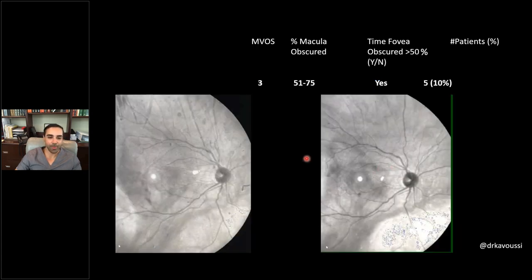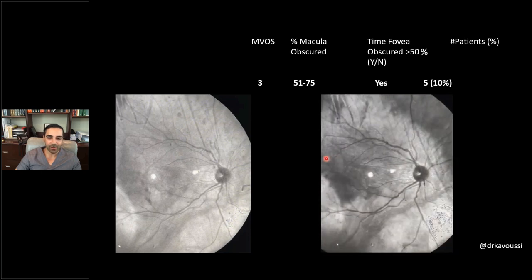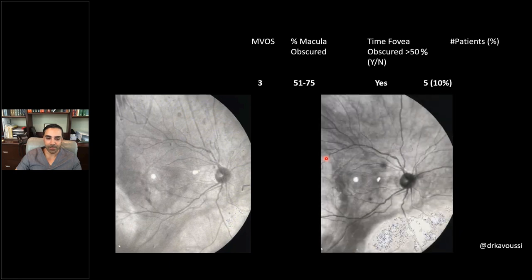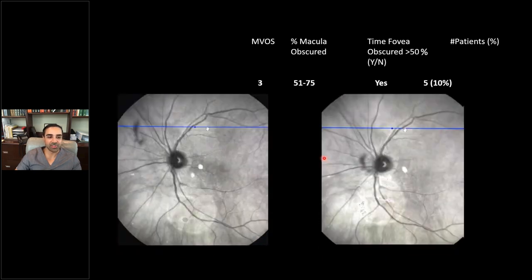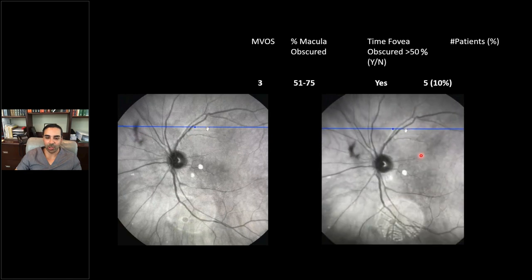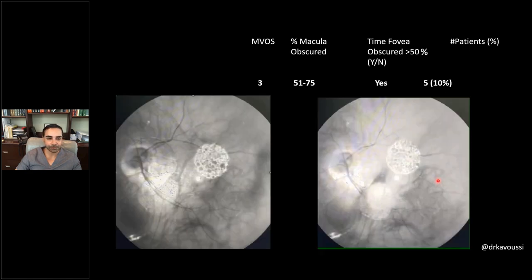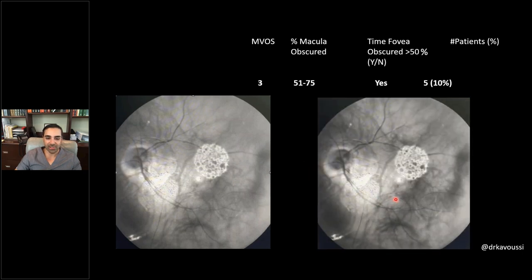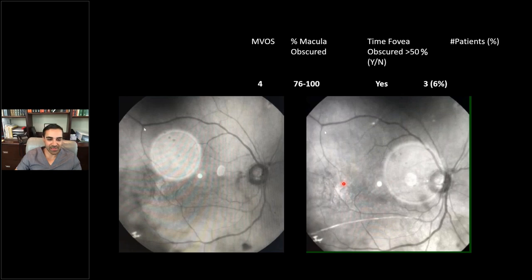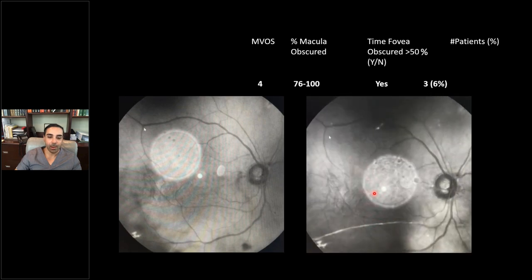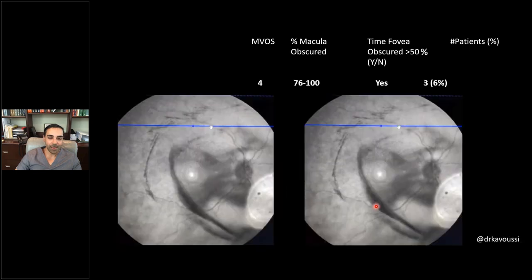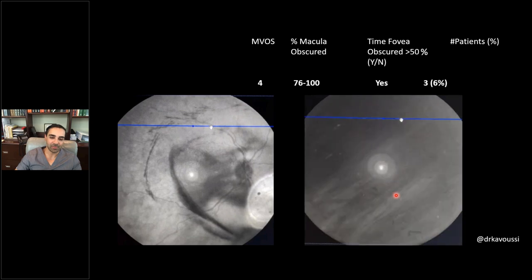Grade 3 involves opacities covering more than half of the macula — you can see them much better when you activate the video. On another grade 3, the still photo shows a Weiss ring nasally, but the video reveals a large circular opacity not otherwise visible. Large opacities involving more than half the macula obscure the fovea more than 50% of the time. Grade 4 opacities very commonly are hemorrhagic PVDs — more than three-fourths of the macula is involved, sometimes nearly the entire macula covered by a large clot.